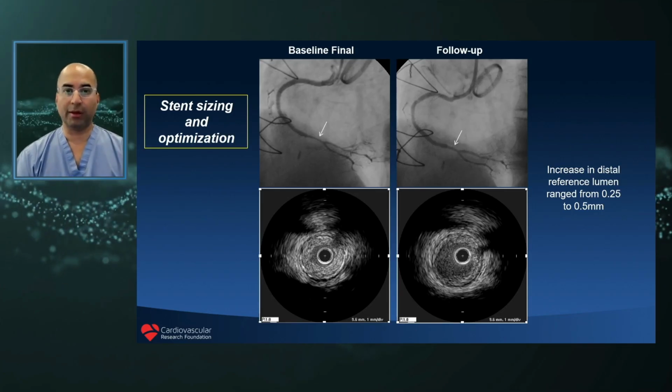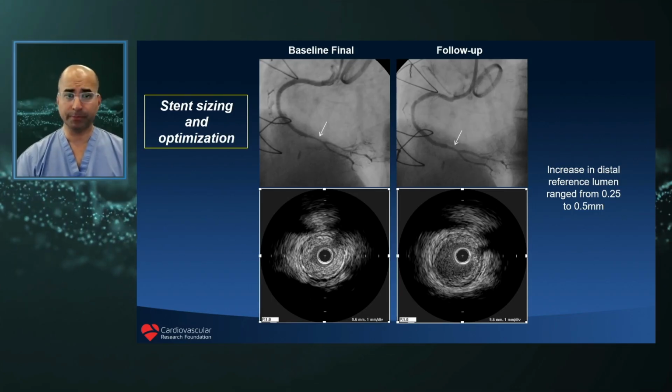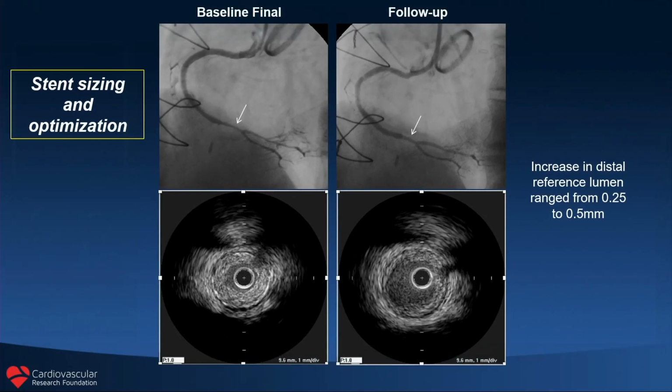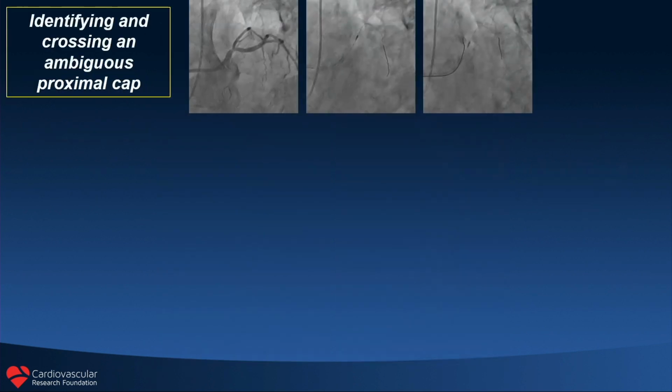This is just another example of the distal vessel, a case where you see stents are implanted, and this doesn't look like a great result, but by IVUS, it's not a ton of plaque there. And then in follow-up, there wasn't any plaque, it just got bigger over time. So this attribute of what to do with the distal segment is something that we may bring out in the cases that we talk about as the live cases are done, but you have to be judicious and not just stent all the way down and keep going with your stents as long as there's no hematoma.